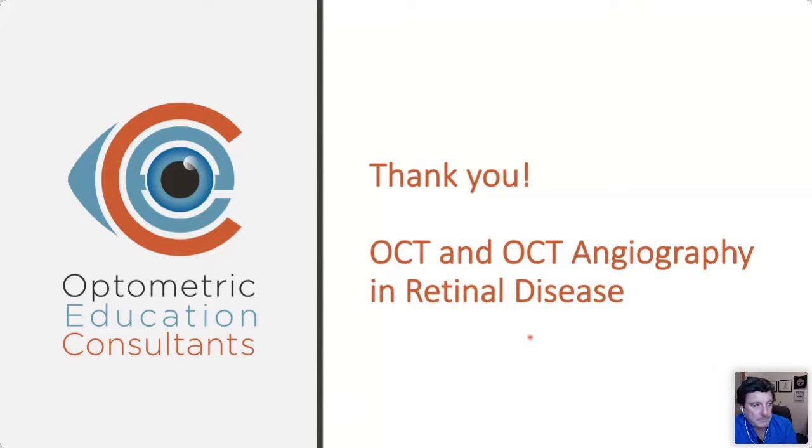Good questions. Great. And we have one final question. Does your OCT-A have blood flow analytics? Mine does, yes. My OCT-A does. So not all of them do.